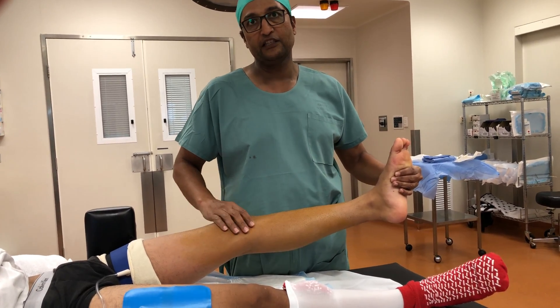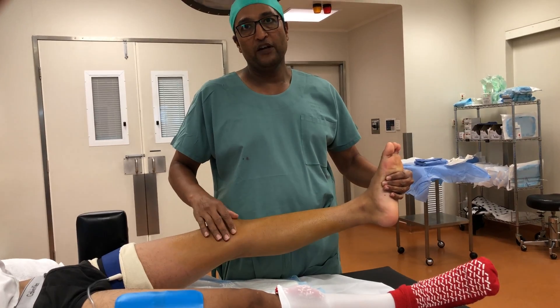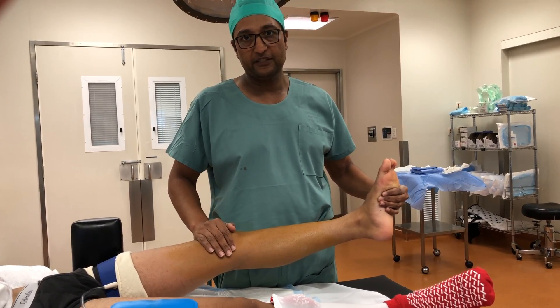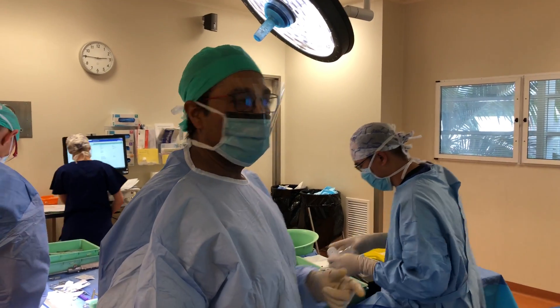That's because the meniscus is locked between the two surfaces of the articulation. What we're going to have to do is the ACL reconstruction and repair the meniscus.